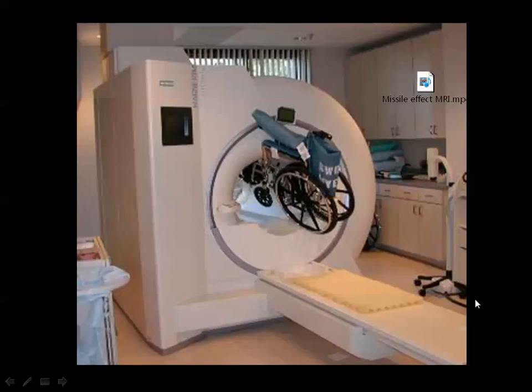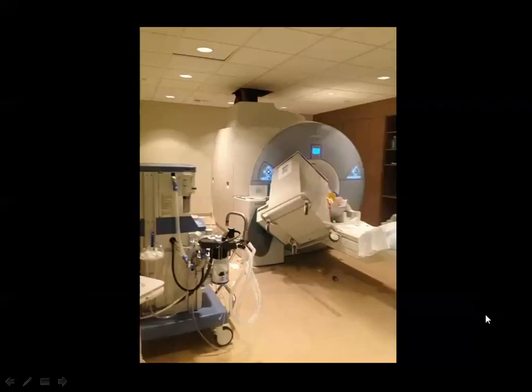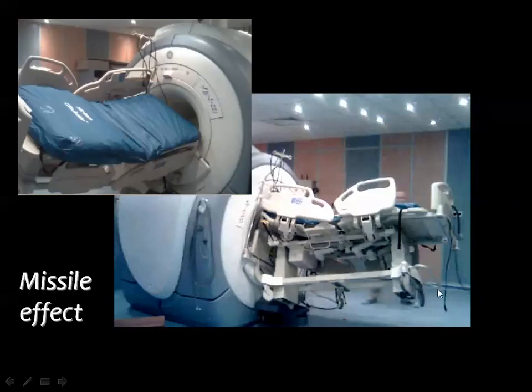And these accidents happened many times in the beginning era of MRI until the magnet was shielded internally. And as you can see here, this is one of the beds that has been pulled up from the ground and hit the MRI machine, and this was known as the missile effect of MRI.